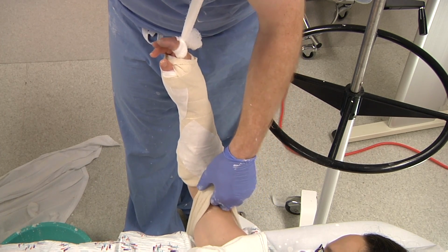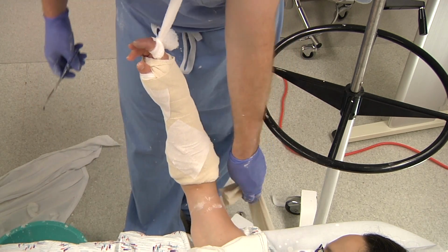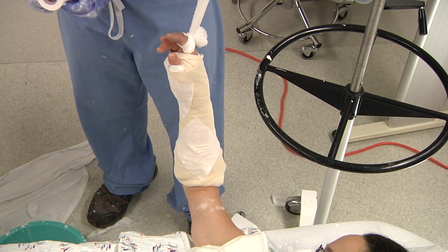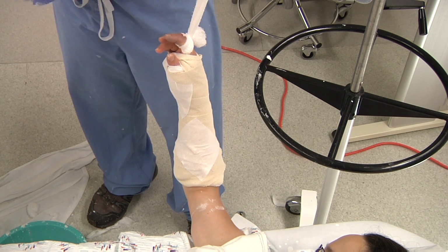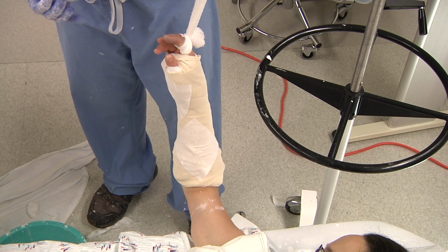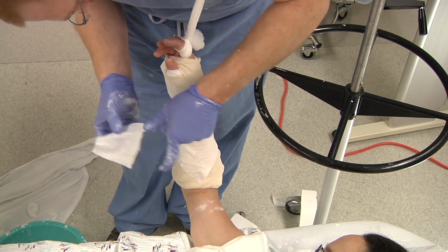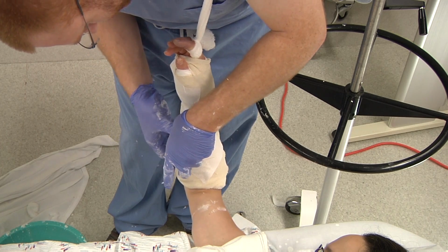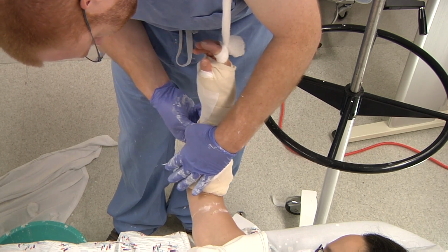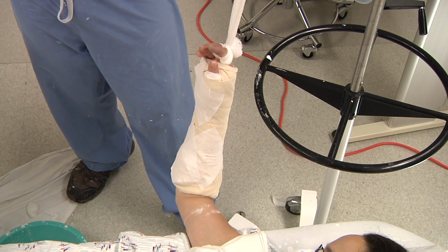And there, easy to cut it off. And then from here, as long as we like our reduction, we're happy with our splint, move on to securing your bias with tape.